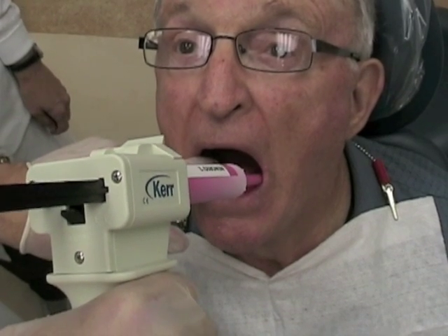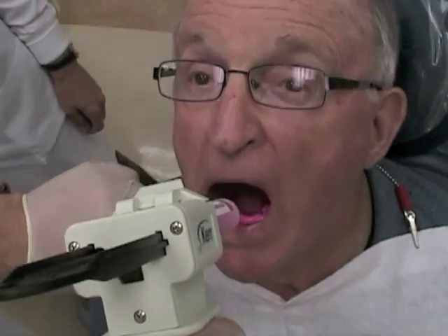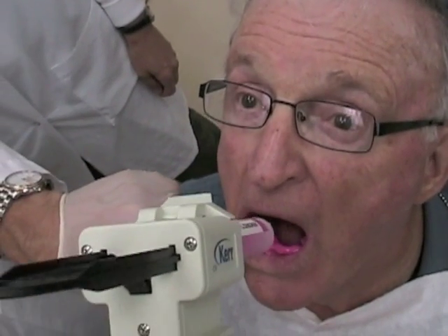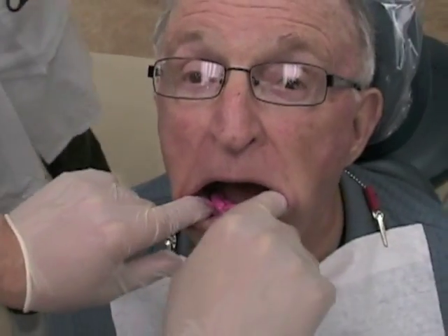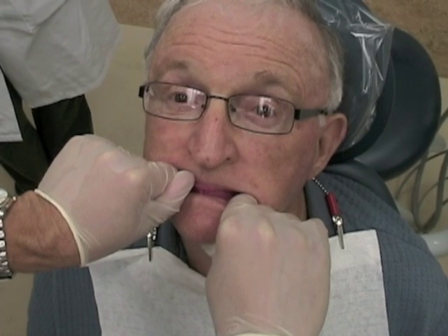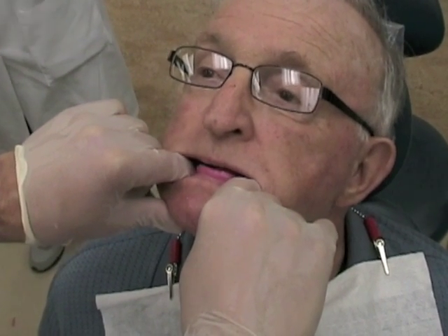Make your protrusive record by placing polyvinyl siloxane bite registration medium on the occlusal surface of the mandibular rim. The maxillary rim should already be in place. Have the patient protrude their mandible at least four to six millimeters. You may want to have practiced this previously before using your material. If you've already created two millimeters of maxillary overjet, the patient need only protrude four millimeters to get a full six millimeters. Stabilize the rim to make sure the patient doesn't move during the record.